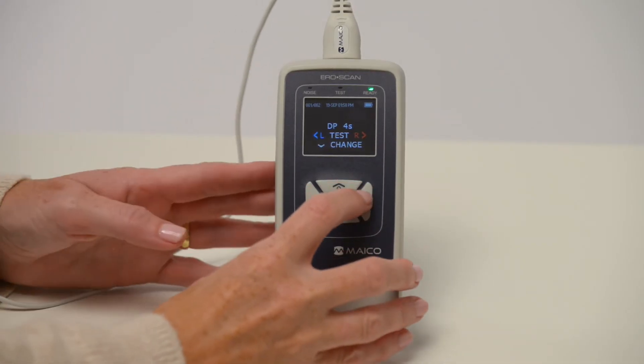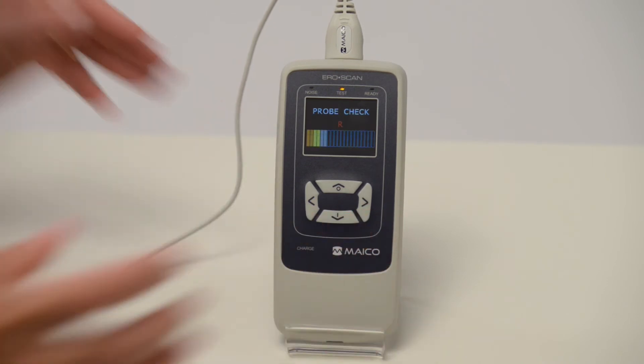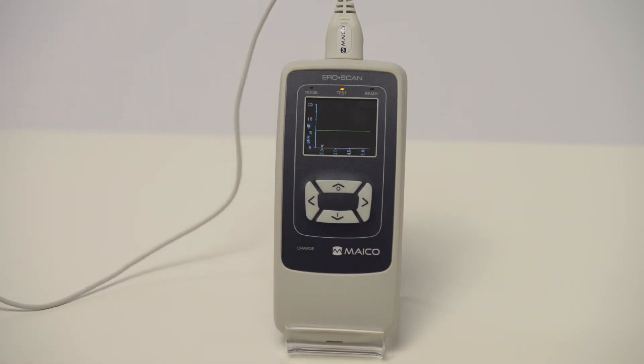Select ear by pressing left arrow for the left ear and right arrow for the right ear. The probe check will start automatically followed by the OAE test. In the event the test does not progress, try repositioning the probe or changing ear tip size.